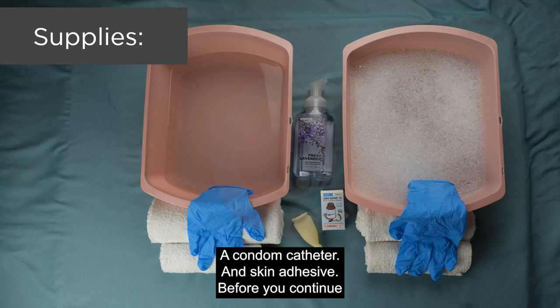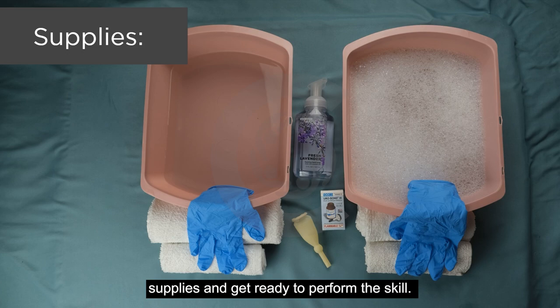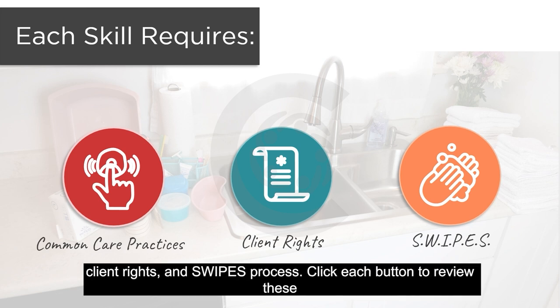Before you continue, gather your supplies and take some notes — it will help you prepare all the necessary supplies and get ready to perform the skill. When assisting your client, remember to incorporate your common care practices, client rights, and SWIPES process.